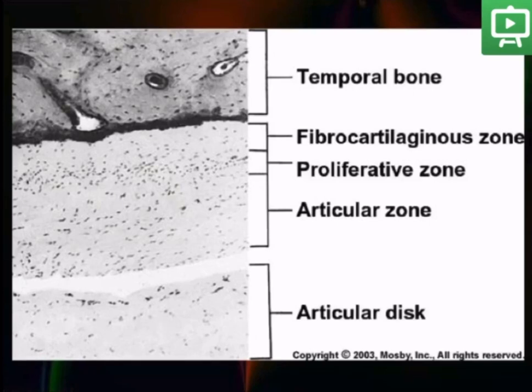made up of cartilage-like cells, the proliferative zone, where we see abundant cells, and the articular fibrous surface made up of collagen, mostly collagen type 1 fibers that are parallel on the surface and more vertical or perpendicular in the deeper zone.